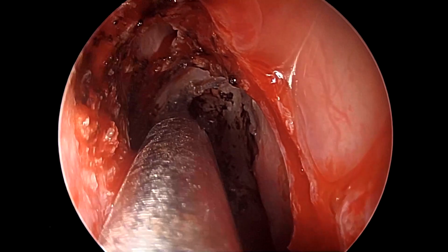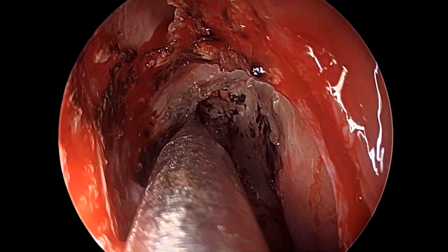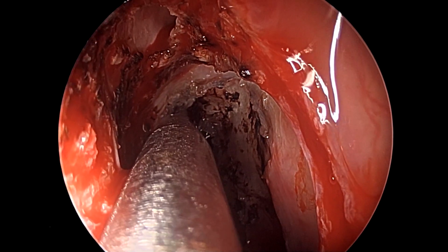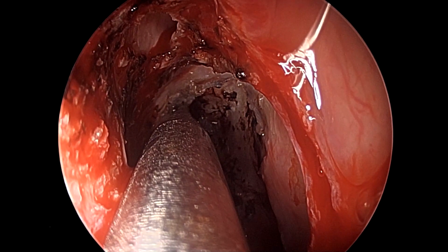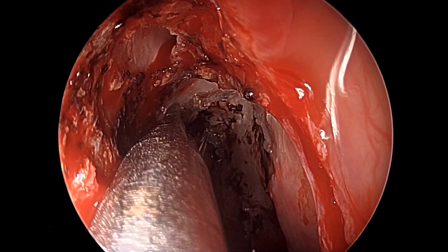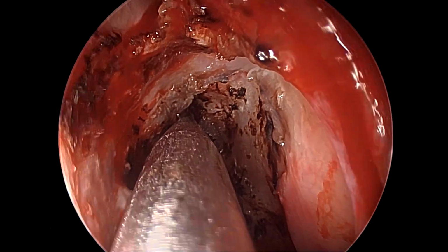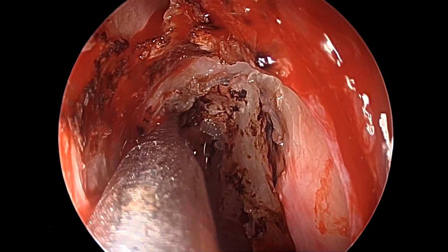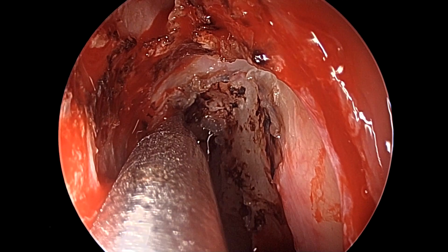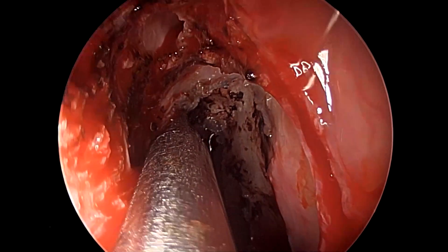Now, once this has been bared, we're using here a navigation probe to once again reconfirm our site of defect, because the meningocele has been removed, and it is our practice to always use intra-operative navigation in these patients, because once the meningocele or the encephalocele has been reduced, the skull-base defects can be small sometimes and they could be confounding. So to have an intraoperative navigation probe point to the exact place of defect is actually quite helpful.